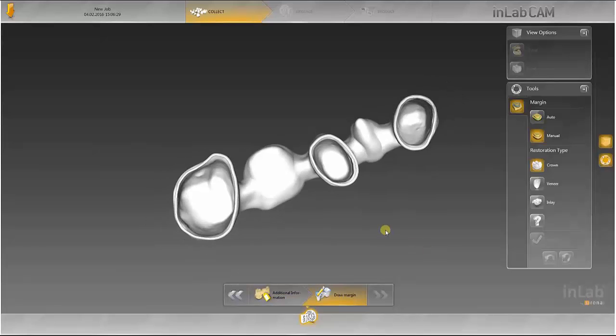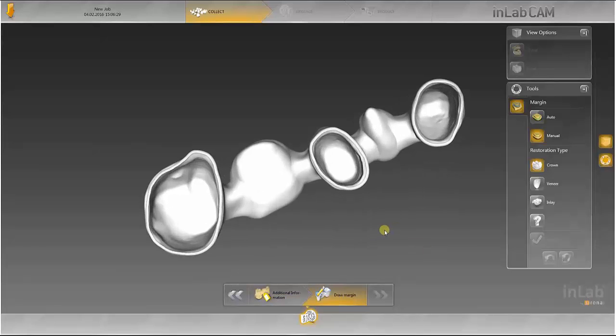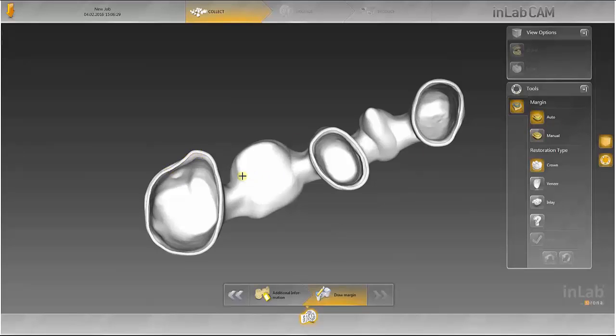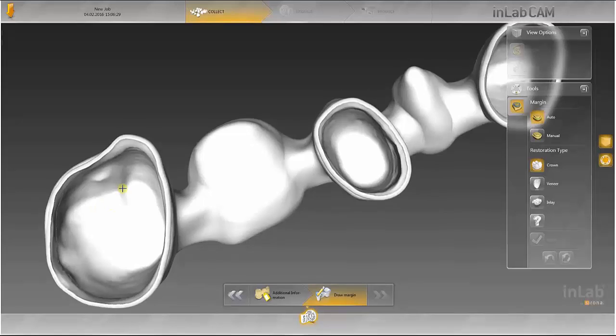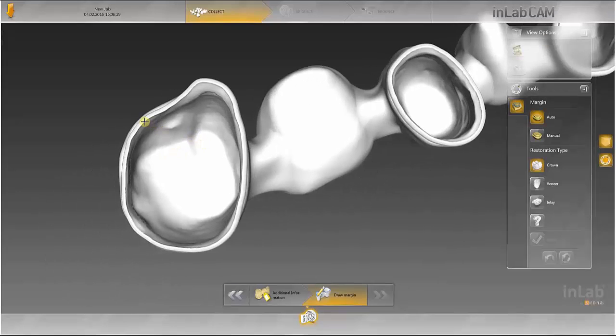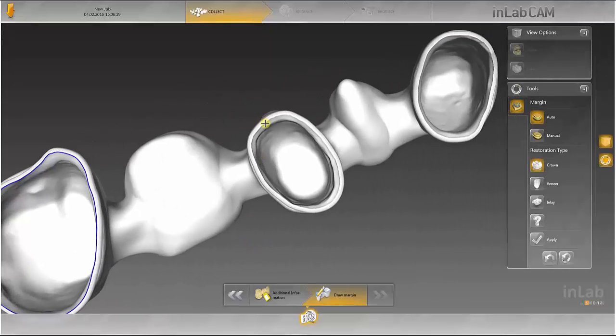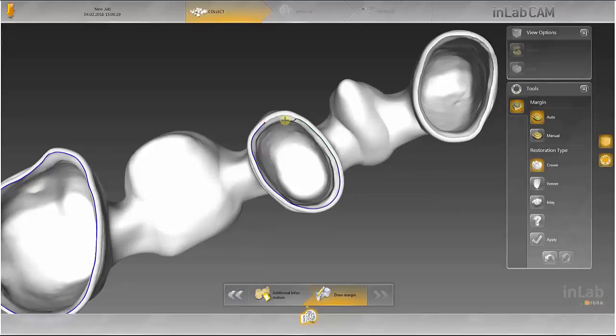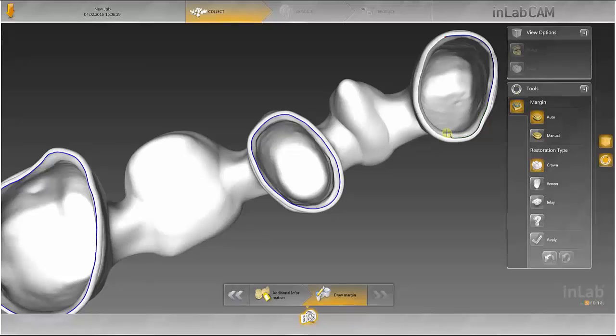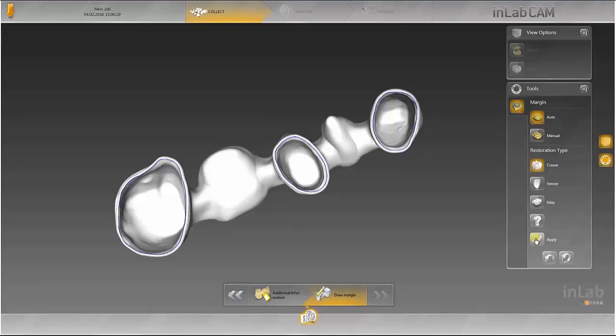Once again, crown is selected as the restoration type and the lines are marked. The bridge is added to the designs by pressing Apply and then the next arrow.